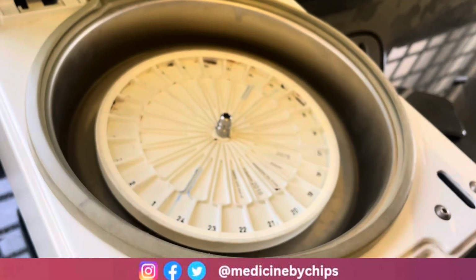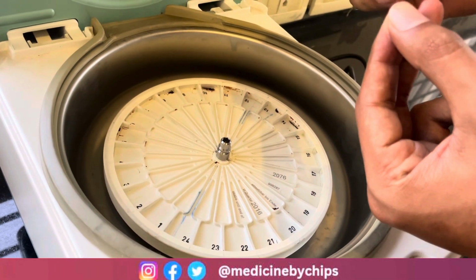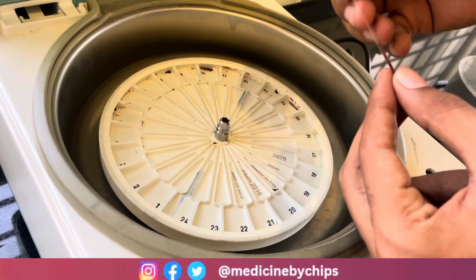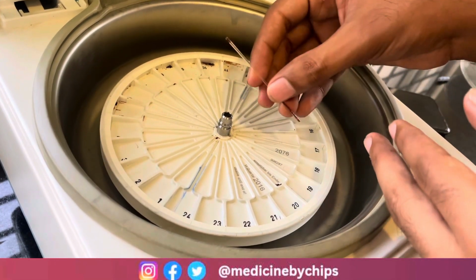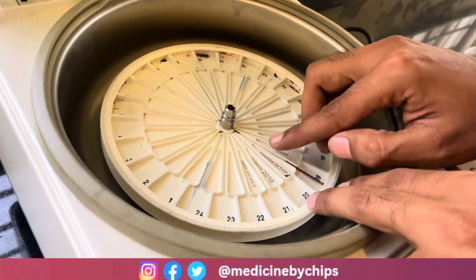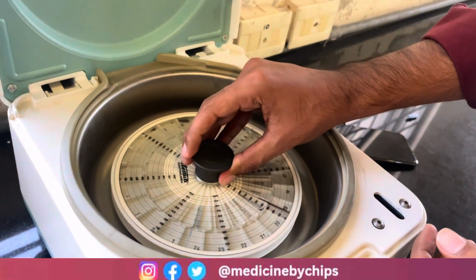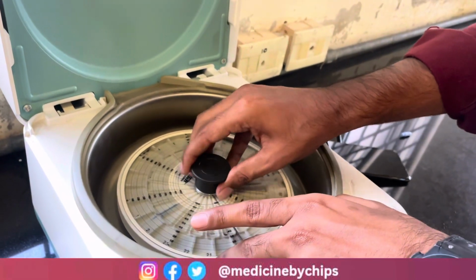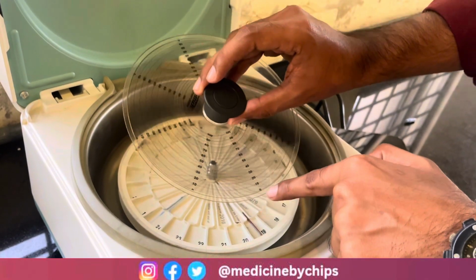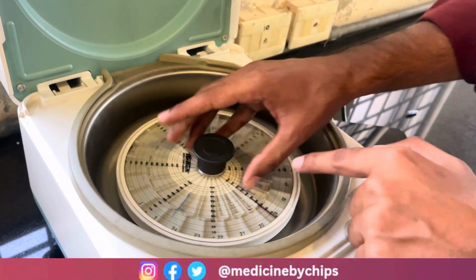In this, we will place the capillary tube so that the end that is filled with the blood covers the end of the hematocrit scale, and the blank end faces the center, so we can place it like this. Now we will cover the plate, so that the reading comes on top of the capillary tube and you can easily count the readings. So this is the place.